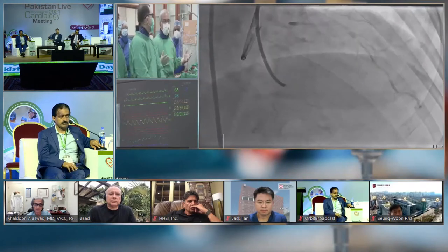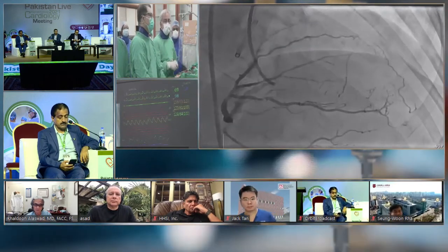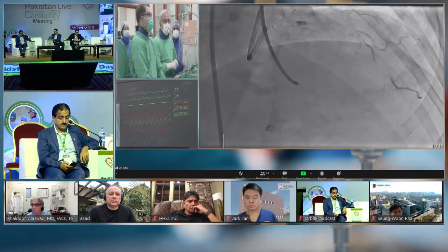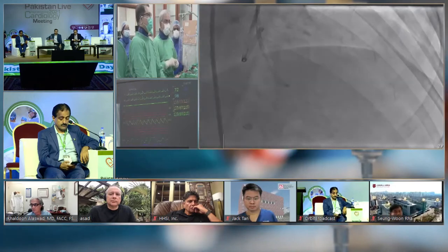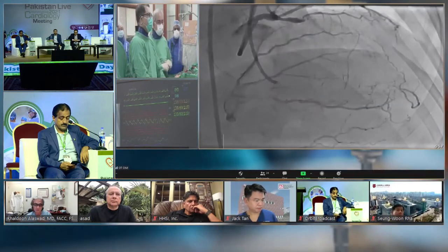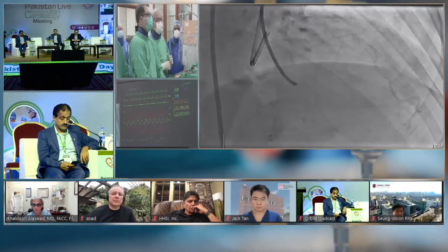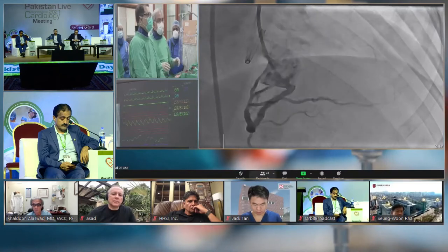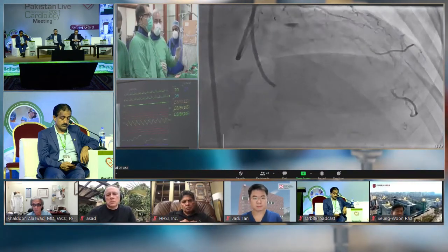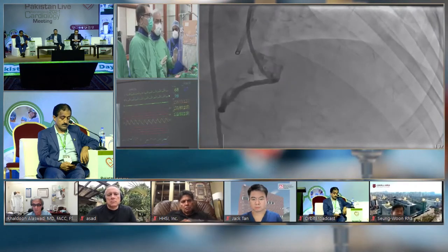I think if this was a tricky case, I'd have a 7 French on the right also. So without this, I would not approach my CTO. When I start my CTO, I want my fellows to do everything precisely. You should not try and outthink a CTO. If you want to do a serious CTO, everything has to be the same every time. So by the time you come in, this takes about 20 to 30 minutes, your fellows should put 7 French guiders on the left and right side with good supports. It's very important.